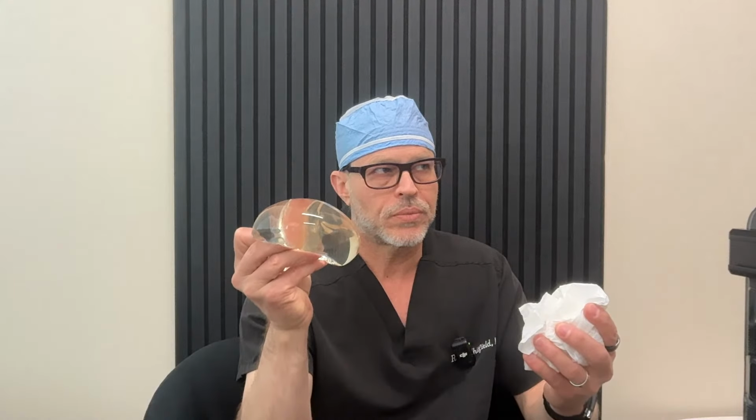We'll talk about this. So here's a silicone device. If you just were to take this out and leave the tissue in place, a lot of times it looks like a little wadded up, crumpled up piece of paper like this. Now, there's a couple problems with this. One is the myth that it just dissolves. That is not something that I found, and I do several thousand explants. So having done all those explants, I can tell you that that's not the case.